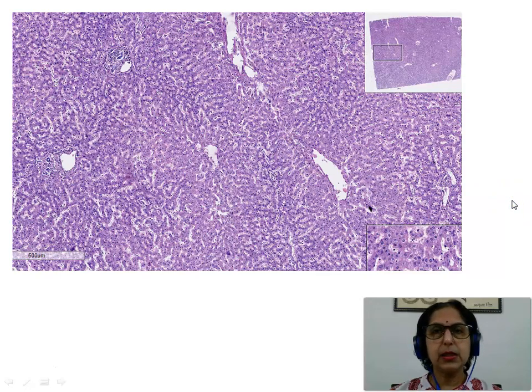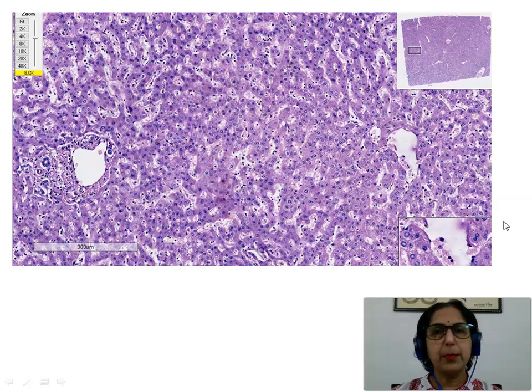This here is an Aperio ImageScope picture of the histology of liver. We appreciate the classic liver lobule with the central vein at the center and portal triads at the angles. Another high power view of the same image shows us a central vein. We see radiating cords of hepatocytes. We appreciate that each hepatocyte is polygonal or hexagonal in shape with a rounded nucleus in the center.